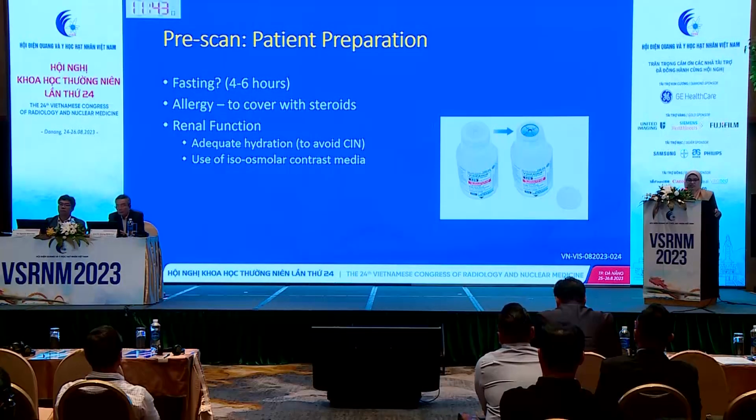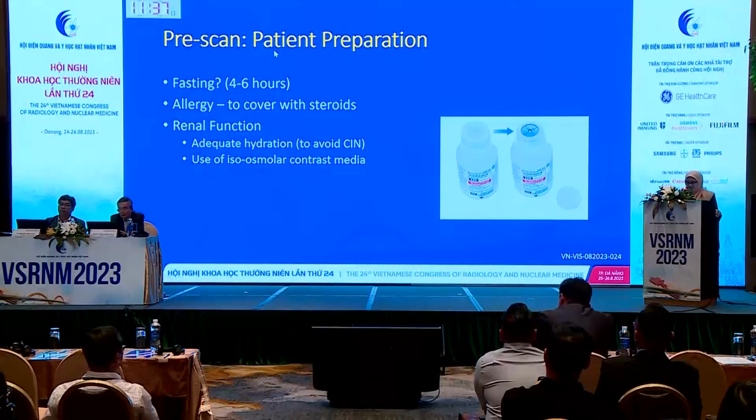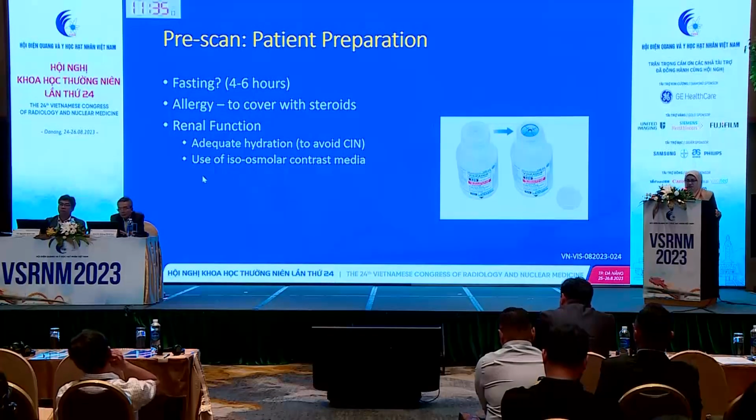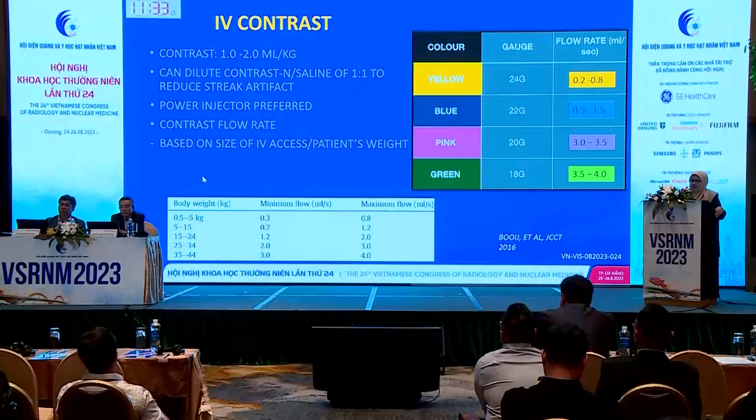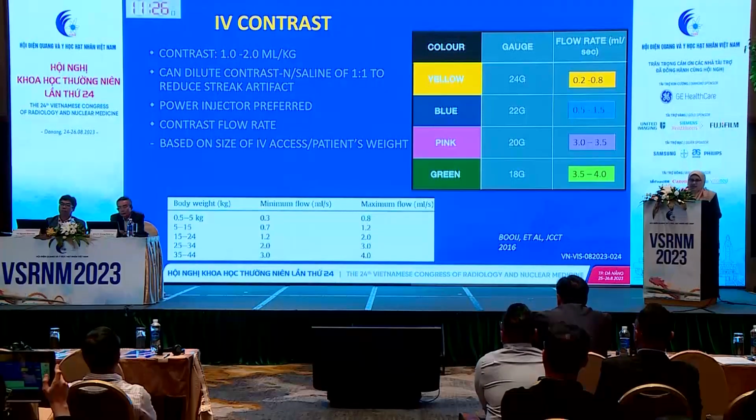But of course it differs, and if patients have some allergy, they should have some pre-medication, and of course you need to be aware of the renal function. Now in terms of IV contrast, this is what is recommended by the journals. So I think you can just look through the internet, it's quite easily available.